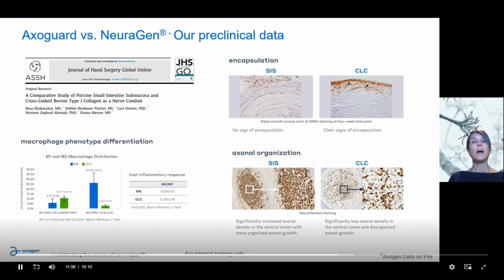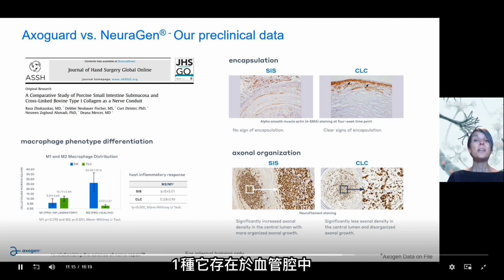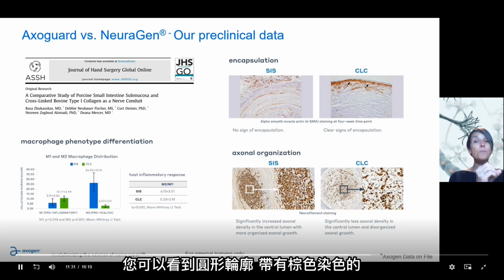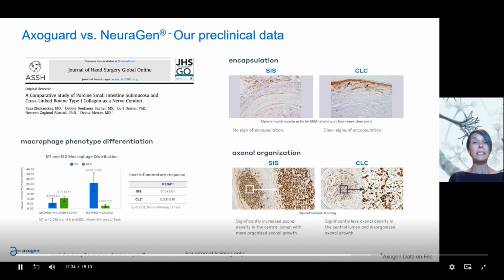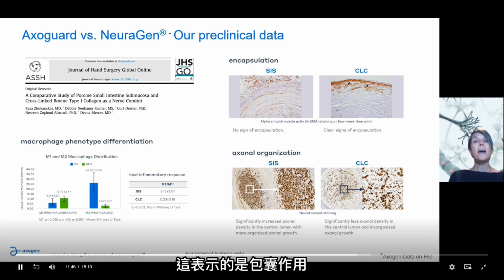Then we looked at a stain called alpha smooth muscle actin. And alpha smooth muscle actin can stain two things. One, it's found in the lumen of blood vessels. And two, it can also be found in scar. And so what we found in the SIS material is that it primarily stained the lumen of the vasculature, which you can see in the round profiles that have brown staining in the picture on the top left. But in the picture on the top right, you see the very dense layer of brown staining in the Neurogen material. And what that is indicative of is an encapsulation response.